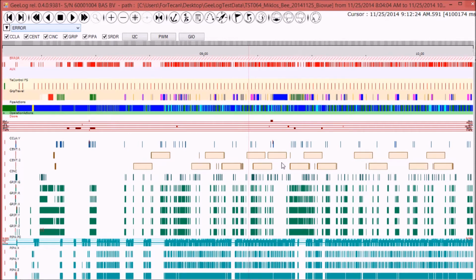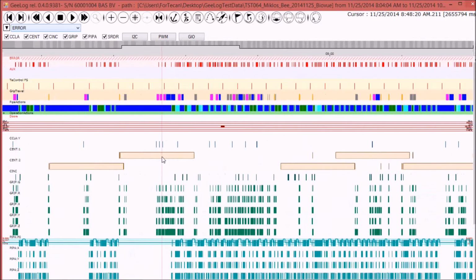This package is aimed, as I said before, to represent intuitively the contemporaneous activities carried on by the different subsystems. And this is done using this metaphor, which is similar to the Gantt diagram, and represents each concurrent activity on a horizontal stripe. So each of these stripes represents one specific activity. A rectangle, one of these stripes, for instance, represents a move.